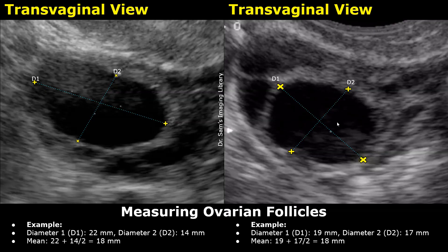This is another example. Diameter D1 is 19 millimeters and diameter D2 is 17 millimeters. Mean diameter is (19 + 17) / 2 = 36 / 2 = 18 millimeters.